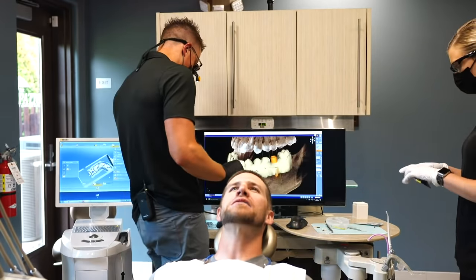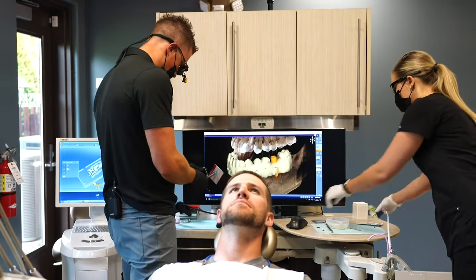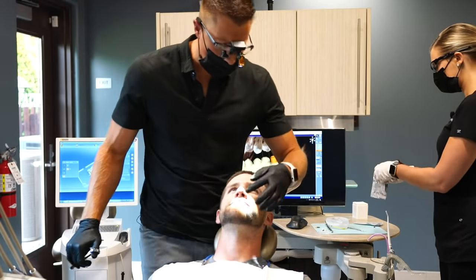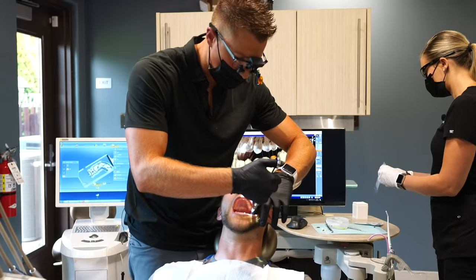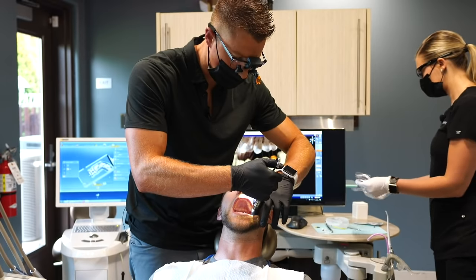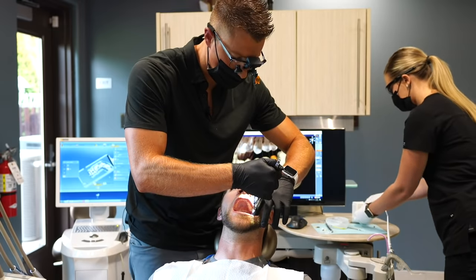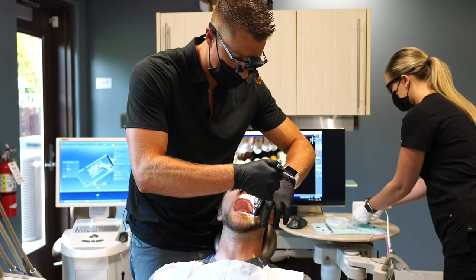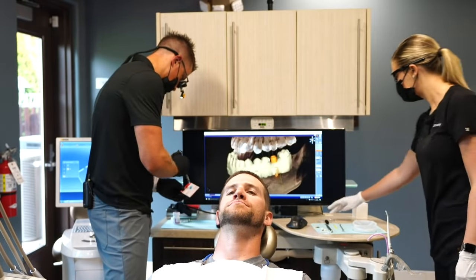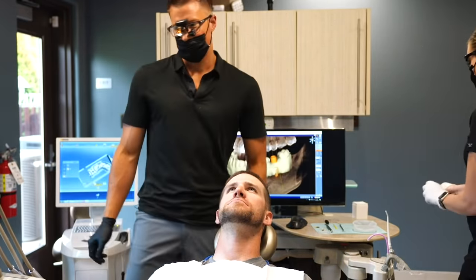Sweet. Don't worry, we're not going to go just yet. Got to get a little bit of time to set up. Are you feeling anything get more numb there? Yeah. Get a little right on your gums. This might pinch just a bit. Good job. Didn't feel that? Good. Well, we'll give it just a minute. It doesn't take too long for that to set in.